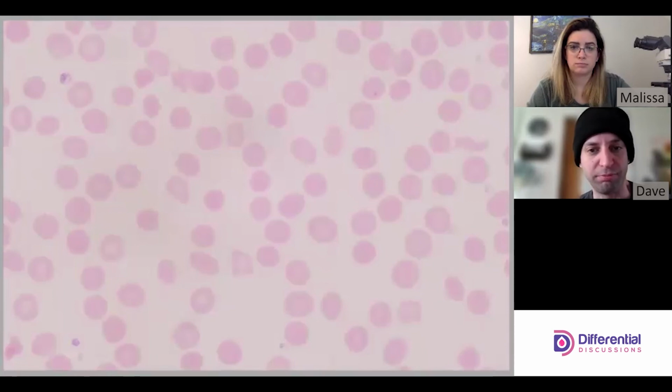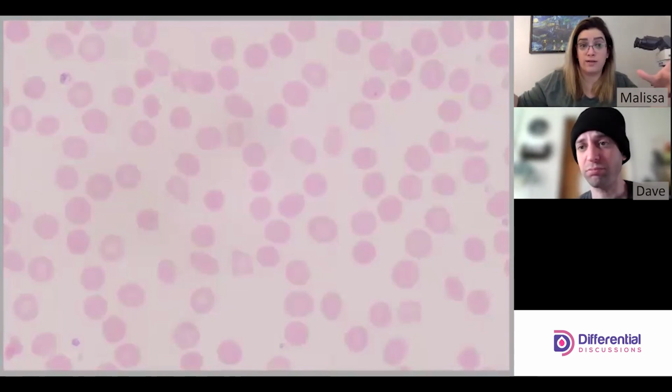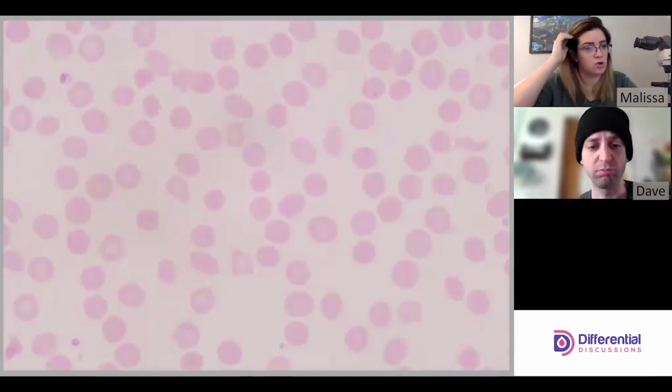Yeah, cool. So, do we have enough to summarize, you think? I think so. Cool. So, this is like 2+ conservatively. I think 3+ echinocytes. What do you think? I think it would go with 2+ on average, just because you have fields like this that are more like 1.5, and then you have some that are more like 2, 2.5, 3. So on average, it's about 2+.